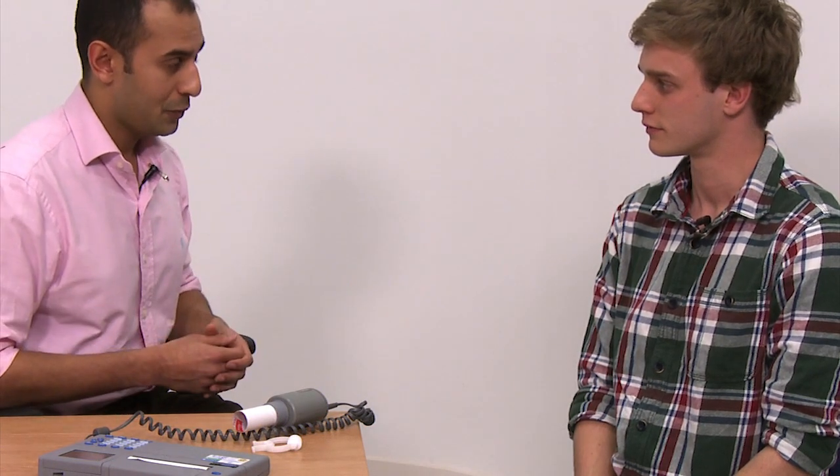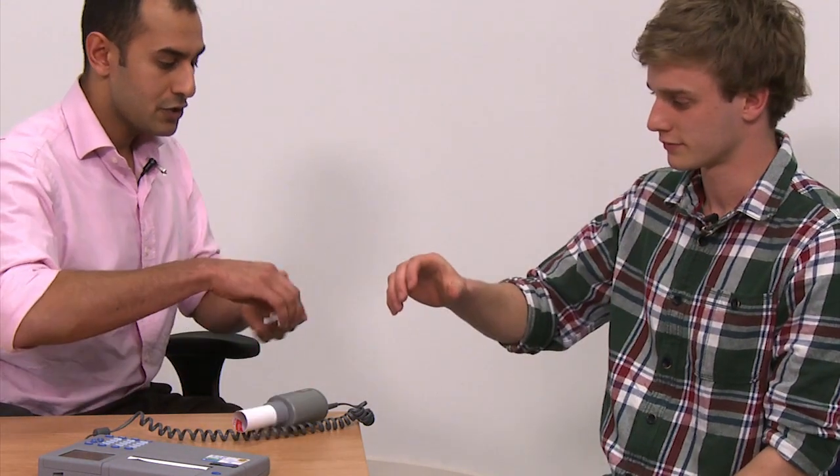So I'd like you to sit up nice and straight. We're going to be measuring two things here: how quickly you can blow air out and how much air you can blow out. I'd like you to take a nice deep breath in until your lungs are completely full. Put the mouthpiece to your mouth as you did before and then blow out as hard and as fast as you can, and keep going for as long as you can. We need you to do that about three times. If you could just put that nose clip on for me — and when you're ready.